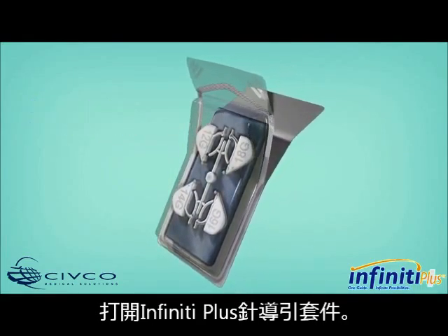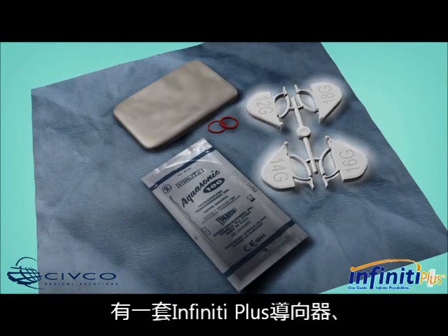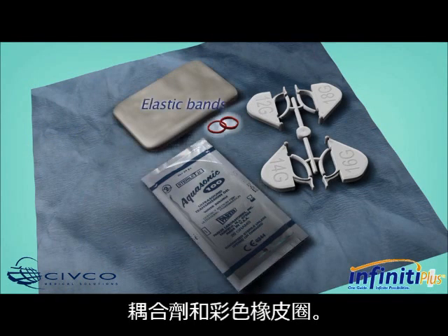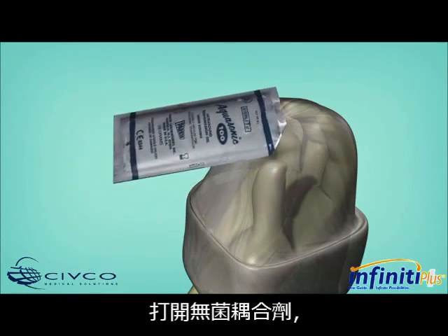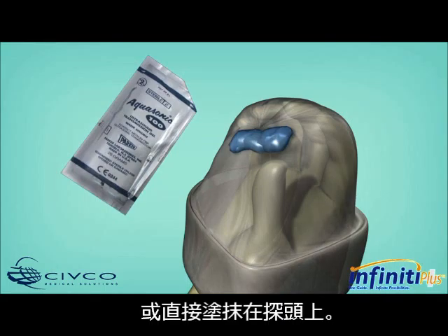Using proper sterile technique, open the Infiniti Plus Needle Guide Procedure Kit. Inside each kit, you will find an Infiniti Plus Needle Guide, a protective CIV-Flex transducer cover, gel packet, and colored elastic bands. Open the sterile gel packet and apply gel to the inside of the CIV-Flex transducer cover or directly onto the array of the transducer.